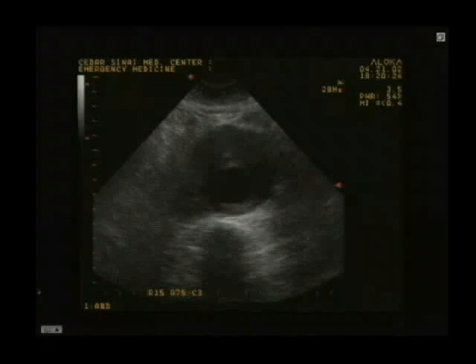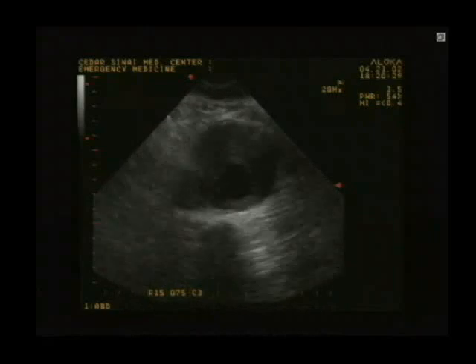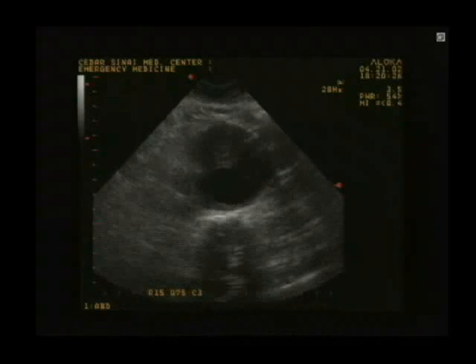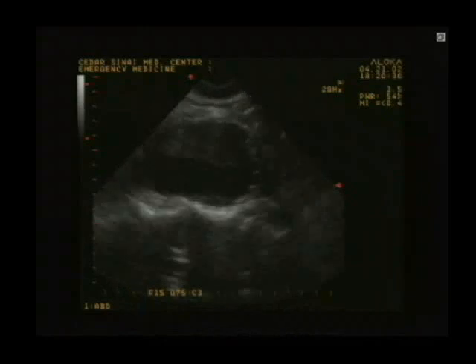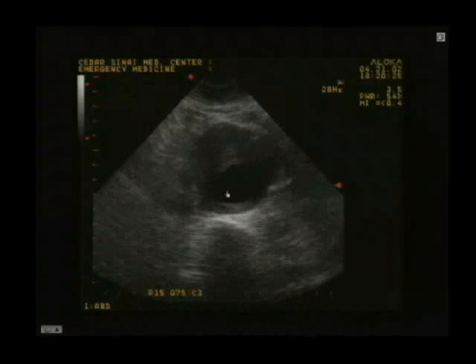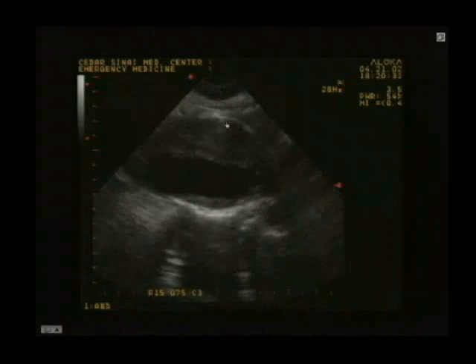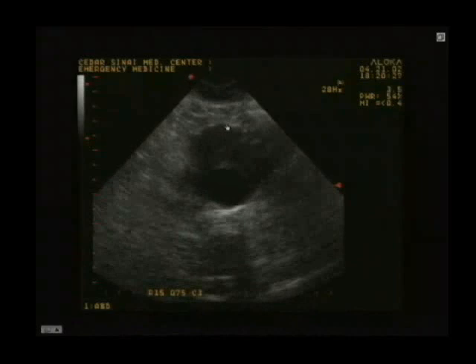Here's another patient that we're looking after. We're scanning the abdominal aorta, scanning transverse. Now this is longitudinal. Does everyone get an idea where the true lumen is and the outer diameter of that aorta is? So this area is the inner lumen, right? That's where the blood is flowing. But the actual diameter is from here all the way to there. Okay? Yeah, that's thrombus. That's all thrombus.